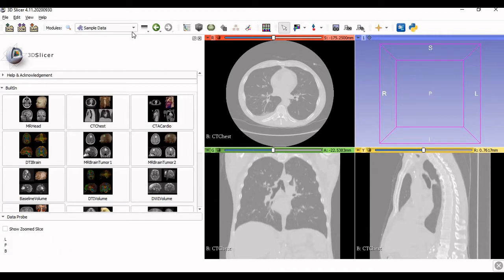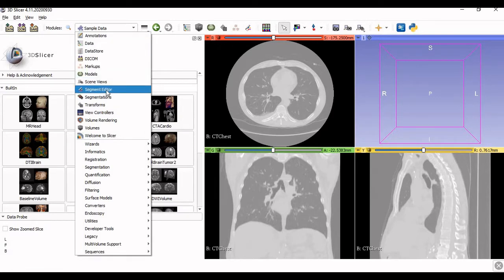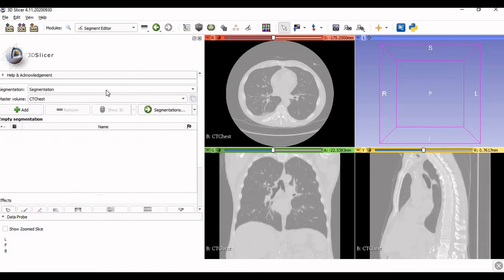Go to the segmentation option in the upper toolbar. There is a dropdown menu — if you click on the arrow you will find 'Segment Editor.' Click on Segment Editor, and once you do, you will get the option to add a new segment. Click on 'Add.'